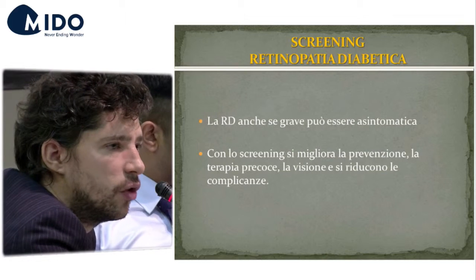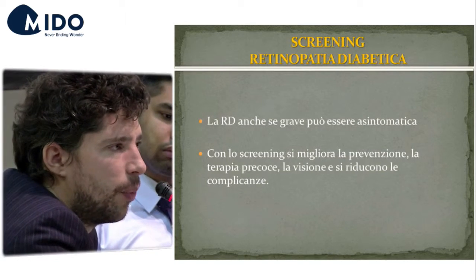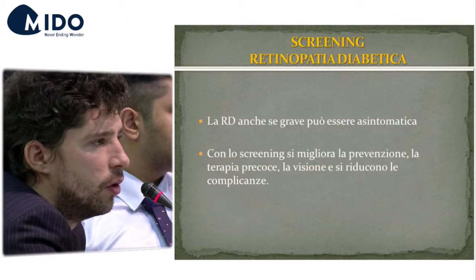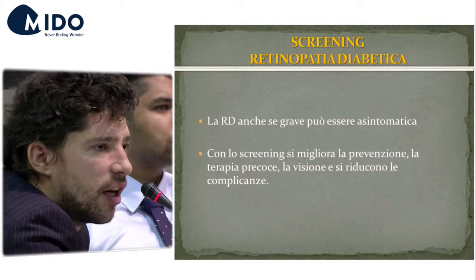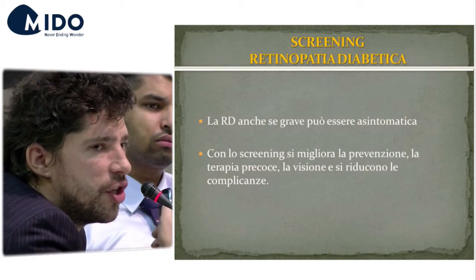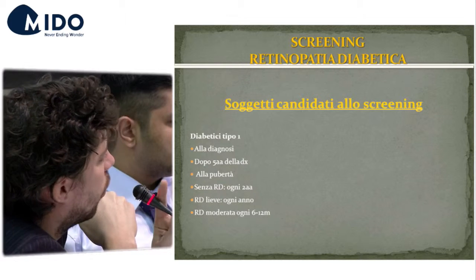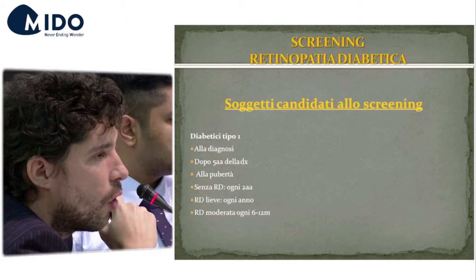The degree of retinopathy varies. In type 1 diabetic patients, macular edema has a later onset than in other cases, and the patient should receive aggressive laser treatment, and the patient can see with 10 tenths. And here you have a scheme on how to manage screening programs.